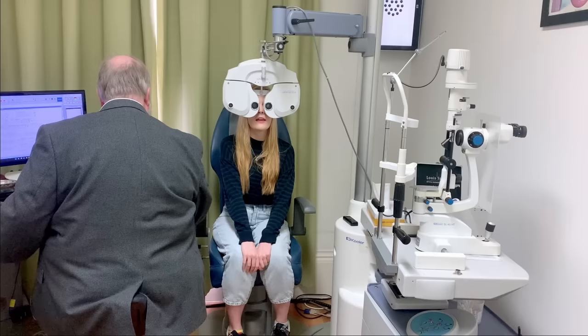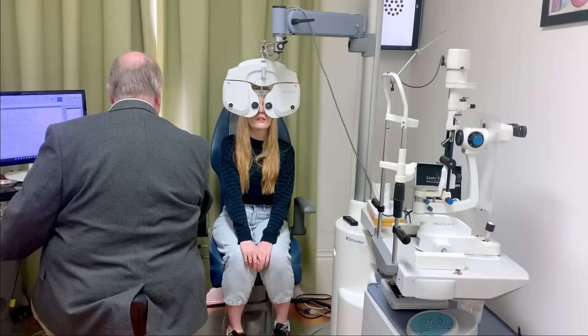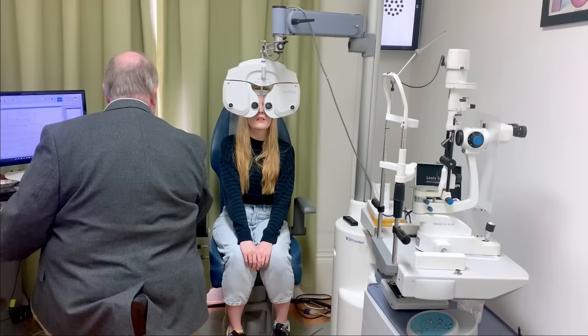Lens one and two again, okay? So any clearer with the first lens there? Or the second lens? Second. And again, the first one. Second one. First one. And that's first again. Second. First. And the first again. Second. And again, any clearer with the first one here? Or the second one? This one right now, I think. That's a little better, is it? Yeah. And again, any better first one? Second one? First one. Lovely.